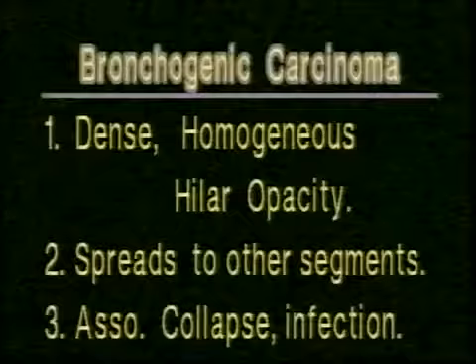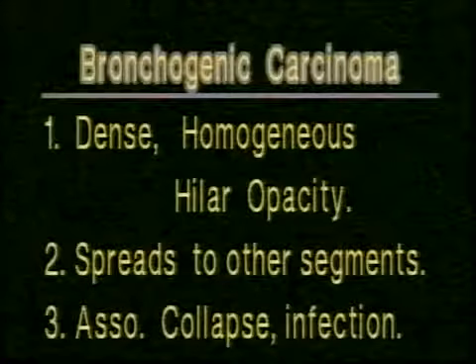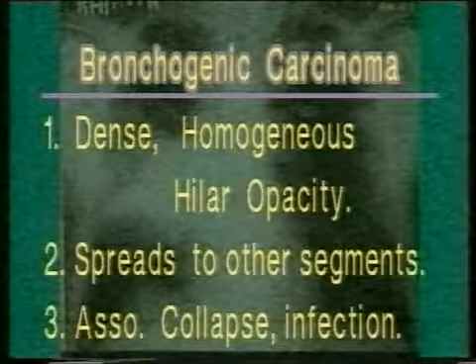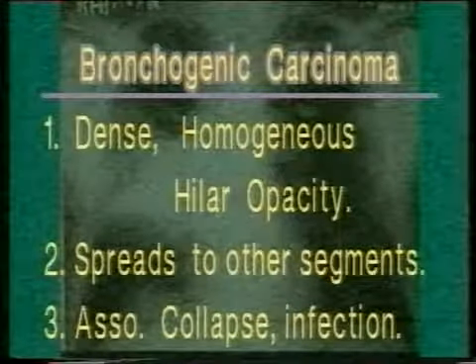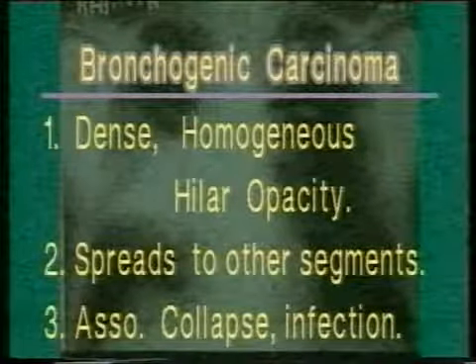We must, however, remember that a normal chest X-ray does not rule out bronchogenic carcinoma, and if clinical suspicion is strong, a bronchoscopy or CT scan should be done even if the X-ray is normal.